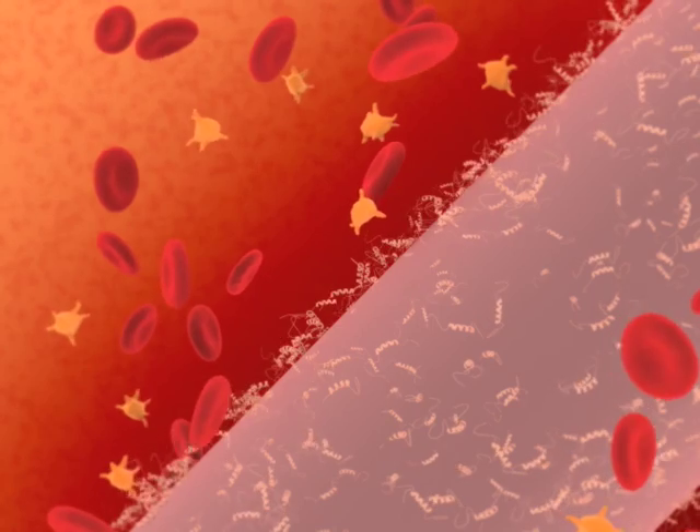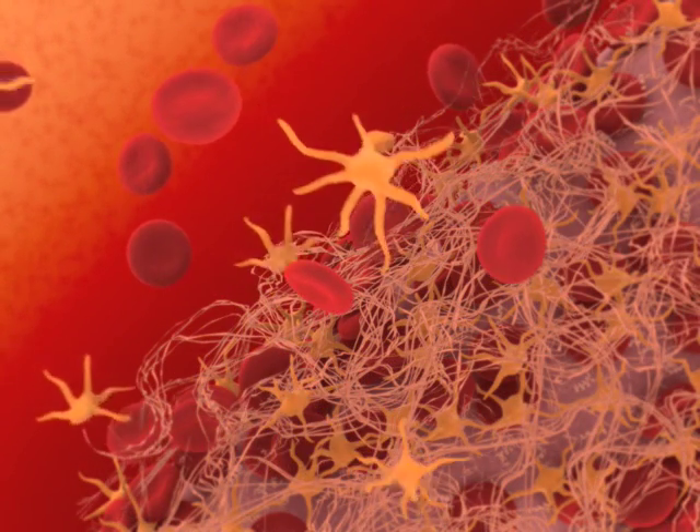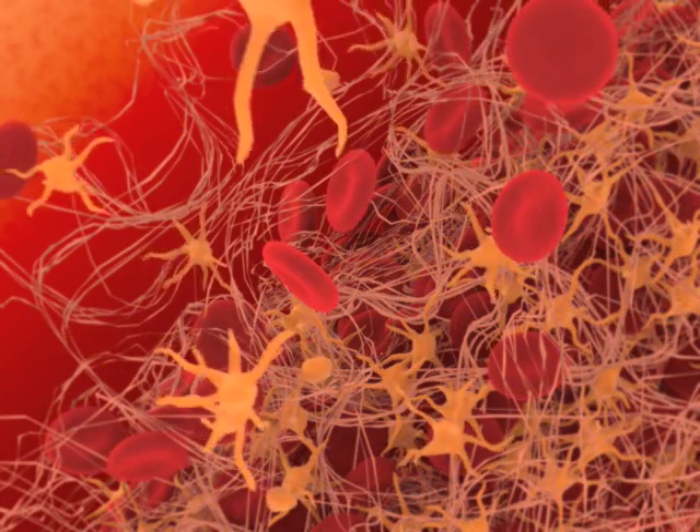Platelets are also activated in this environment due to the original arteriotomy injury. As the result of these powerful coagulation factors, fibrin and clot is formed at a rapid rate.